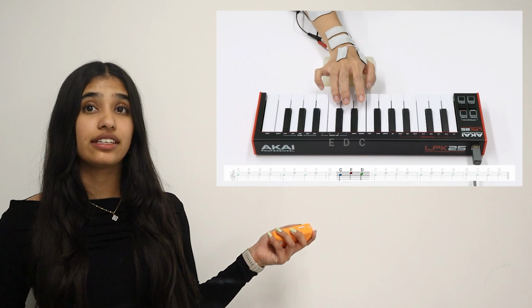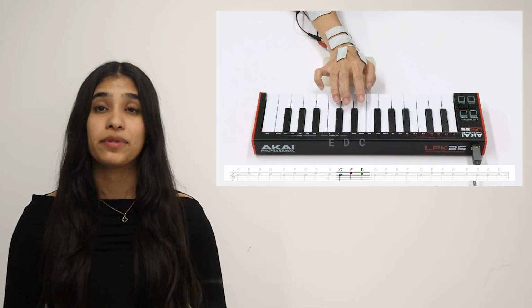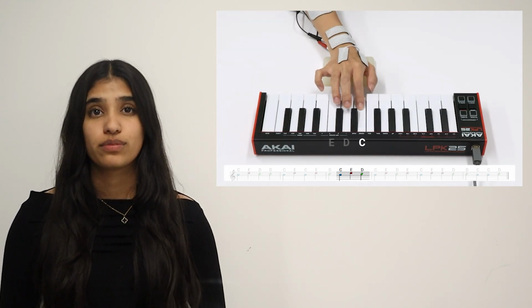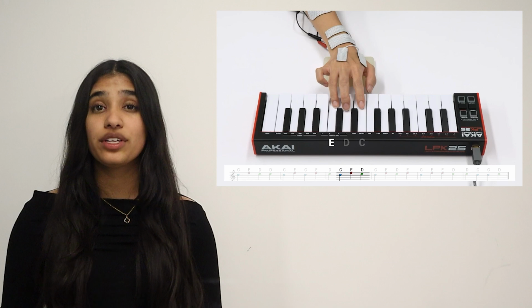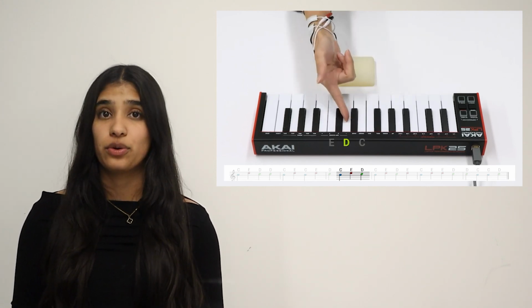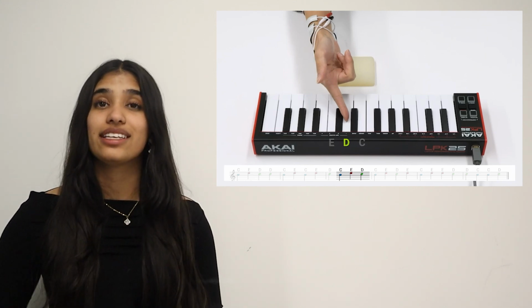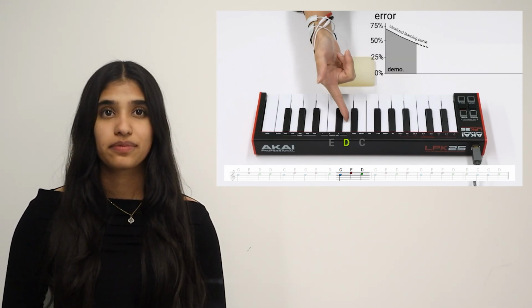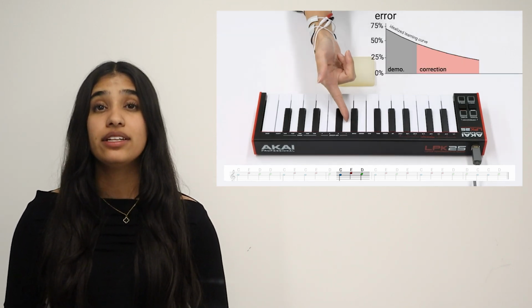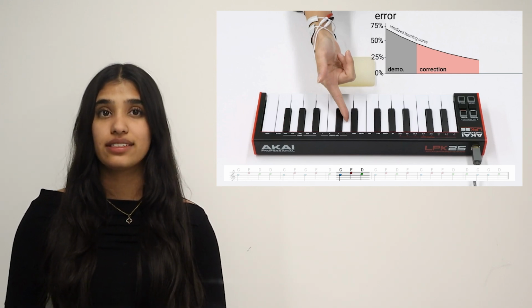Let's say that here, the user manages to learn about half of the melody, but they're still struggling to remember the note that comes after E in this section, which is a D. Instead of showing the whole melody, the system lets the user play and only corrects them when a wrong note was played. This was done by repelling the fingers and then playing the correct note using muscle stimulation. This change occurs because the system adapted to the user's learning curve, and in this case, the system went into what we call the correction phase.